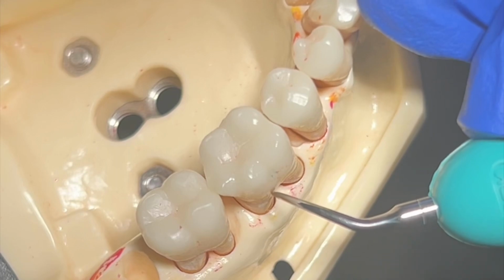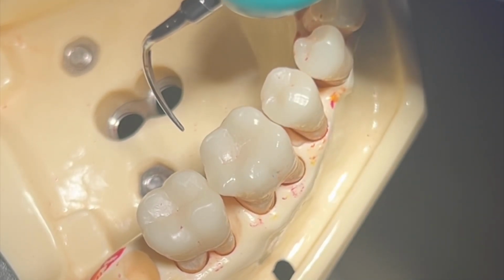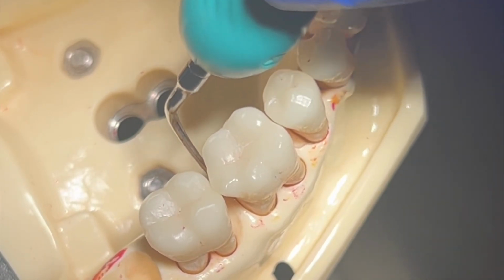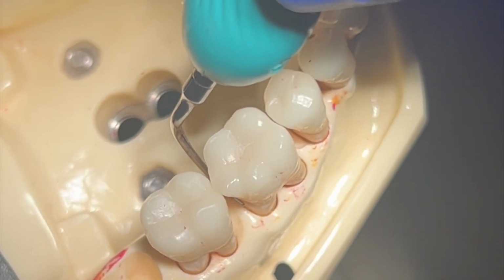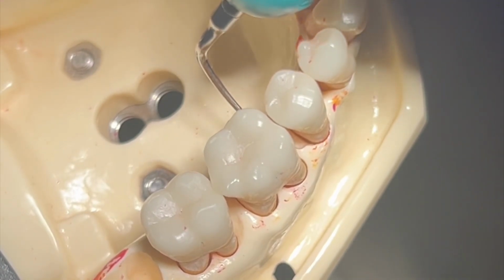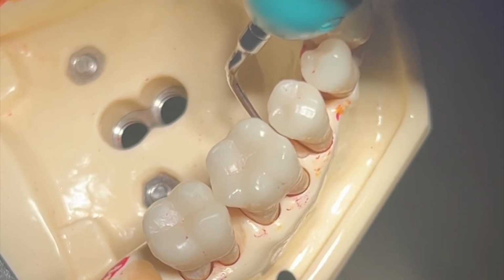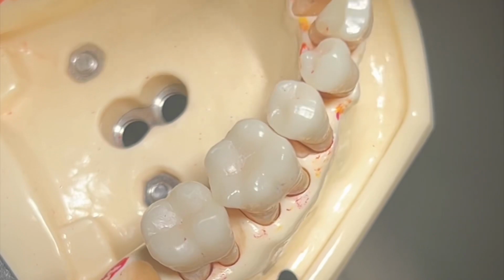When considering the correct adaptation of each insert for the vertical technique, the same insert can be used on the opposite surface for the transverse technique. For example, here we are using the right insert on the lower right buccal surfaces for the vertical technique. With the same insert, we will use the right insert on the lower right lingual surfaces to achieve the transverse technique.